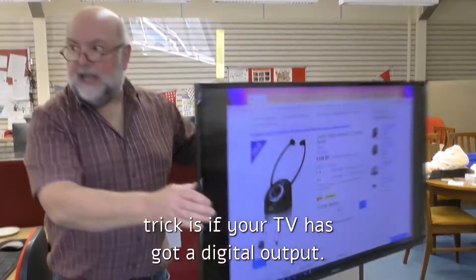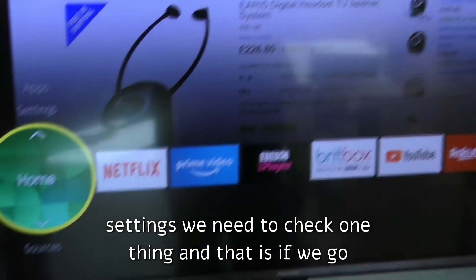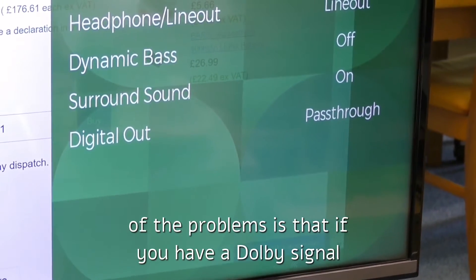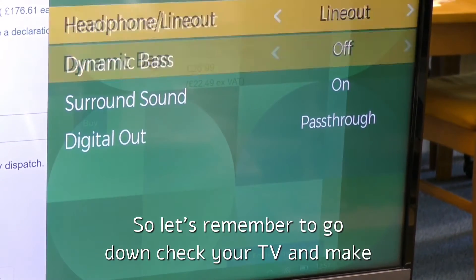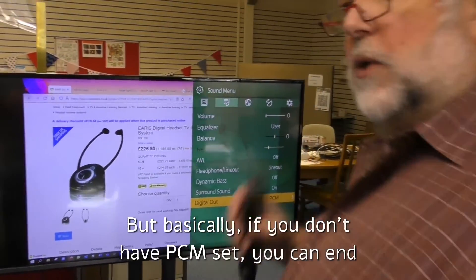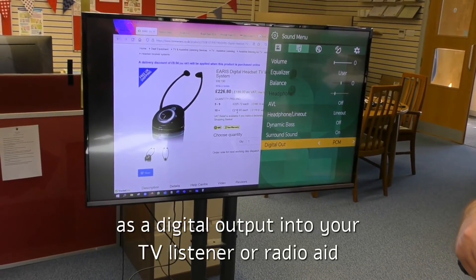There is one last little trick: if your TV has got a digital output, it can sometimes have Dolby on it. So go into the settings, go into sound, and at the bottom it says digital output is set to 'pass through.' The problem is that if you have a Dolby signal going through and you don't have a Dolby decoder, you will end up with a hissy signal. So remember to check your TV and make sure that it is set to PCM — Pulse Code Modulation. If you don't have PCM set, you can end up with a very hissy signal because the unit cannot decode the Dolby signal. So that's connecting your TV using a Toslink, or Toshiba cable, as a digital output into your TV listener or radio aid.